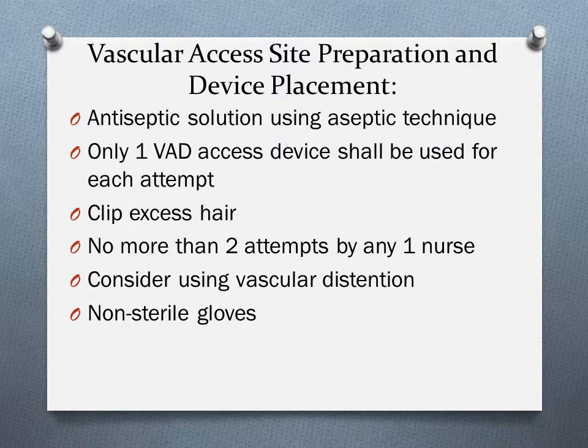Make sure that you use non-sterile one-time use disposable gloves, and use the no-touch technique. So the insertion site should never be palpated after you cleanse the skin unless sterile gloves are worn, without having to re-cleanse the skin.